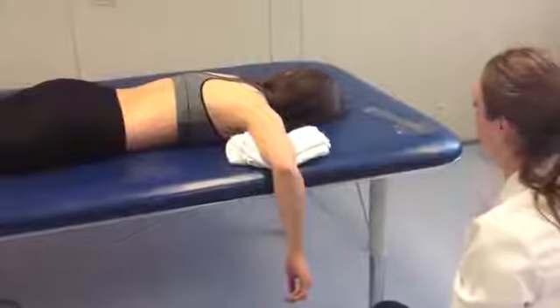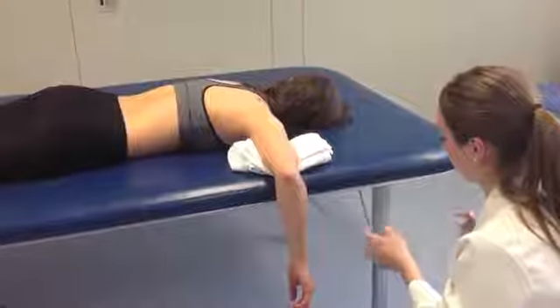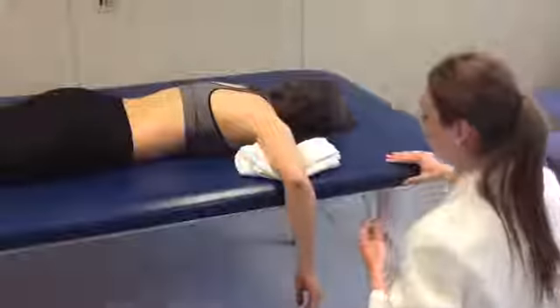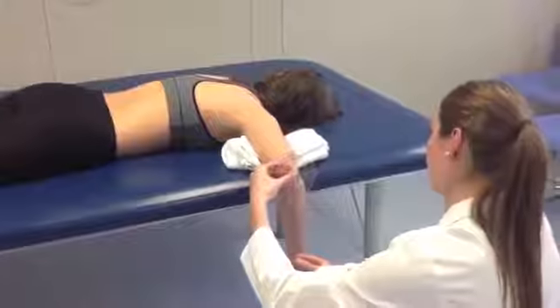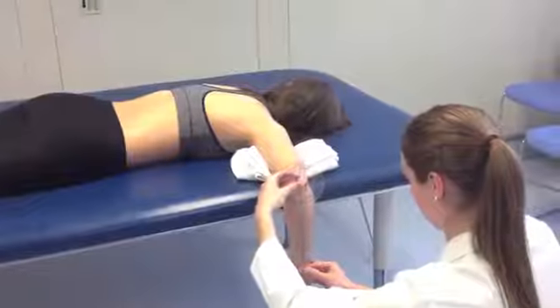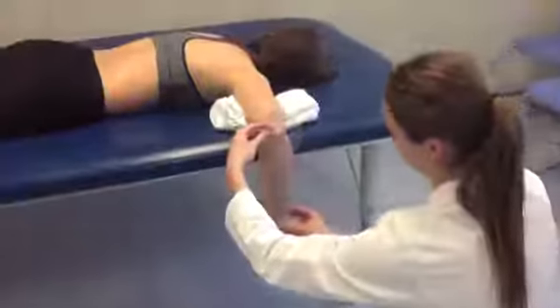If active range of motion is equal to passive range of motion, the therapist should continue conducting the test in the gravity-resisted position. The therapist should make sure to line the goniometer up with the landmarks and place it at eye level. I'm going to line this measuring tool up with your arm, okay? The stable arm should be lined up perpendicular to the floor. The axis of rotation should be lined up with the olecranon process, and the movable arm should be lined up with the ulnar styloid process.